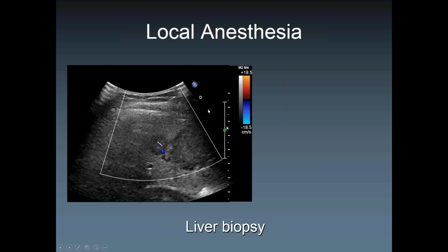Often bleeding happens not within the peritoneal cavity, but in the subcutaneous layers or in the muscles, right? And that's usually either due to muscle branches or due to the epigastric veins and arteries. So here you determine the length of the biopsy path that you need to pick, and depending on this length here, you're going to select the length of your biopsy device.